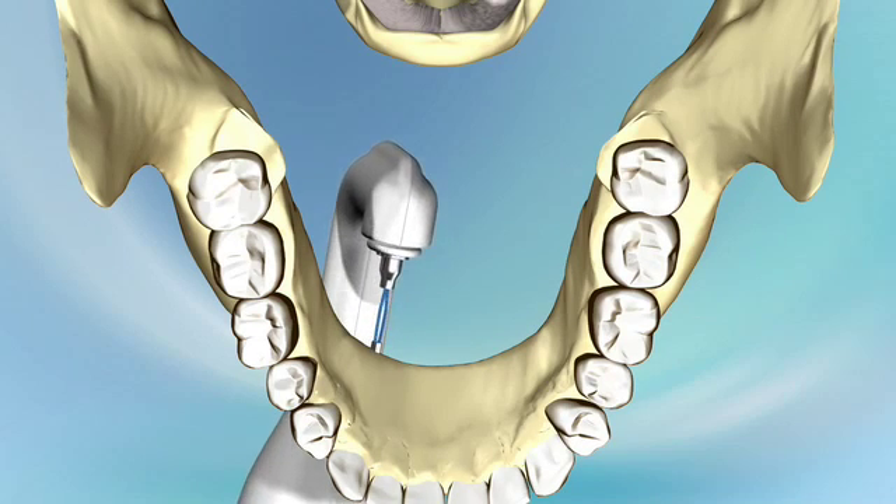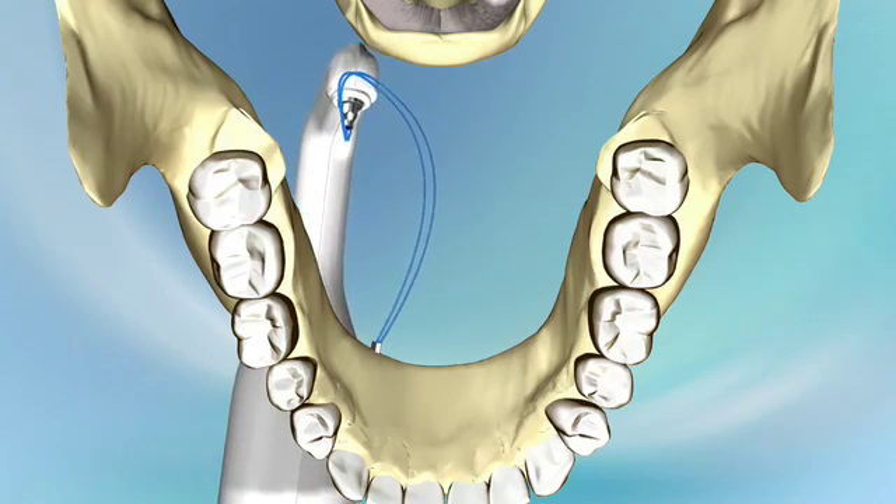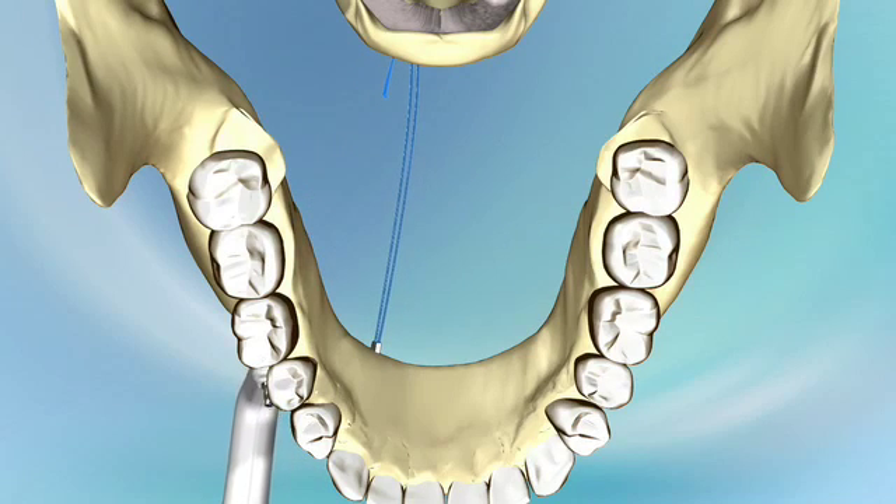Repose bone screws come equipped with two integrally attached sutures fused onto the back end of the screw. The inserter is removed after screw implantation, tailing the sutures from the drive head of the device. The sutures are tagged while the inserter is reloaded with a second Repose bone screw and attached sutures. The surgeon implants the contralateral screw in a similar manner.